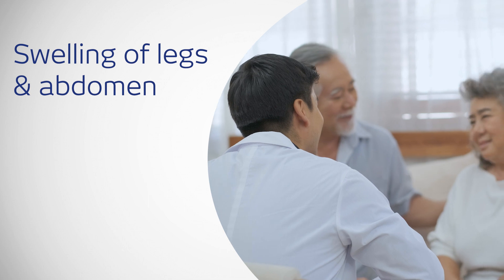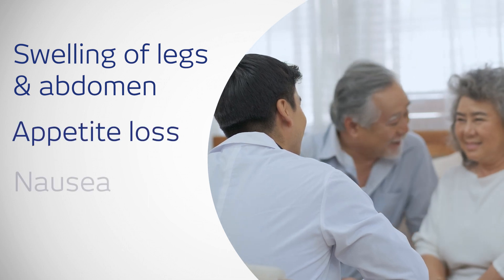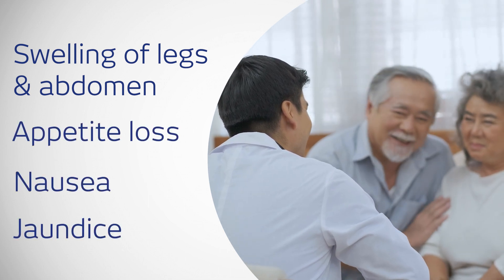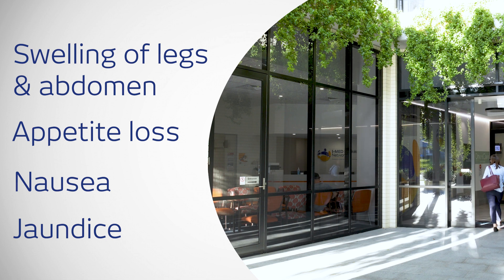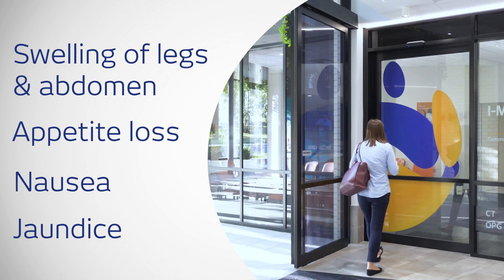If you experience irregular blood results or symptoms such as leg and abdomen swelling, loss of appetite, nausea, or jaundice, your doctor may recommend an MRI of the liver for further investigation.